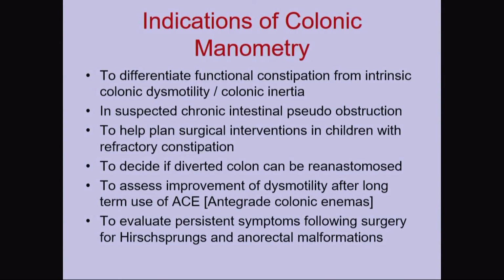retraining. The common indications for colonic manometry are to differentiate functional constipation from colonic inertia, to help us diagnose patients of chronic intestinal pseudo-obstruction, to plan surgical interventions in patients who have refractory constipation, to decide if the diverted colon can be re-anastomosed in a child who has had a colonic resection or a partial resection with ileostomy, to assess improvement in dysmotility if an ACE procedure has been done for chronic constipation, and to evaluate persistent symptoms following surgery for Hirschsprung's disease.